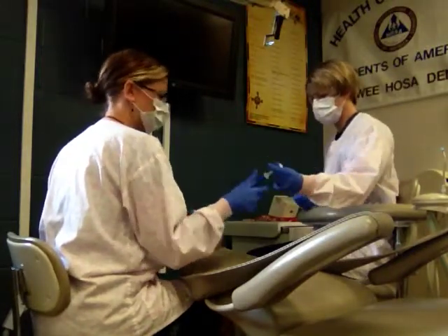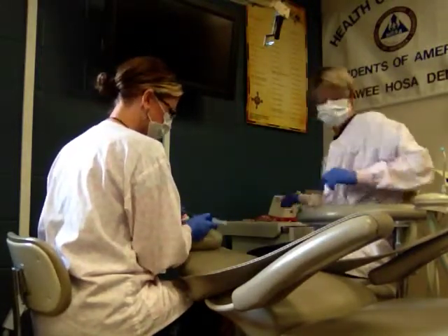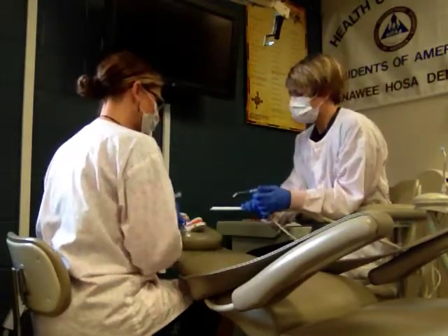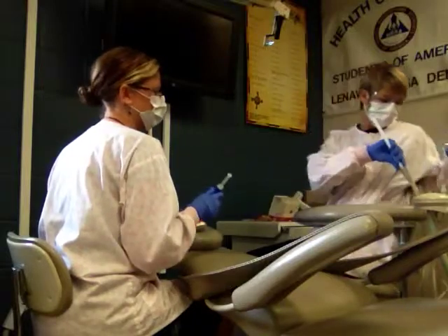Then we're going to use etch, and the etch is going to stay in place. You're going to let it set 10 to 25 seconds depending on the manufacturer, and then the assistant will rinse it off very carefully.